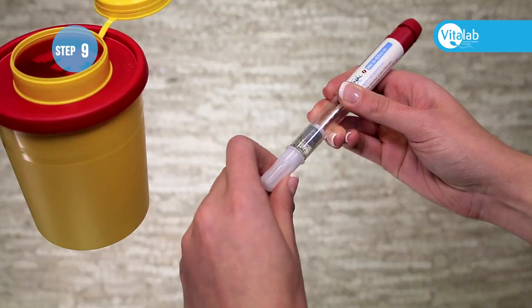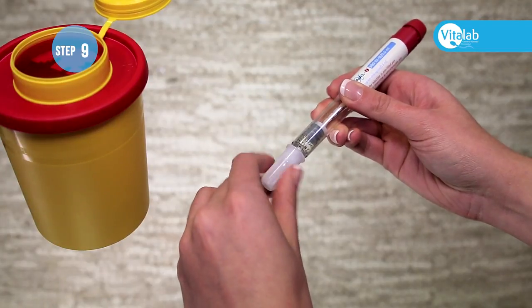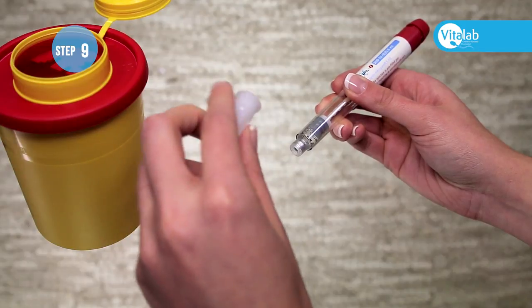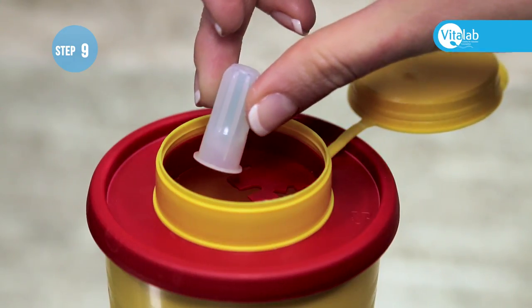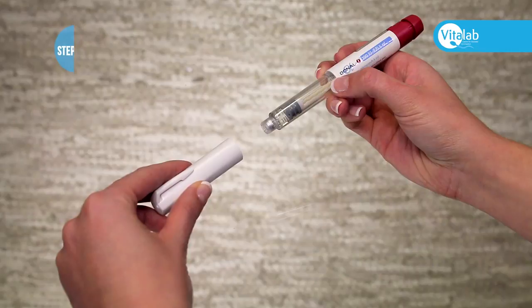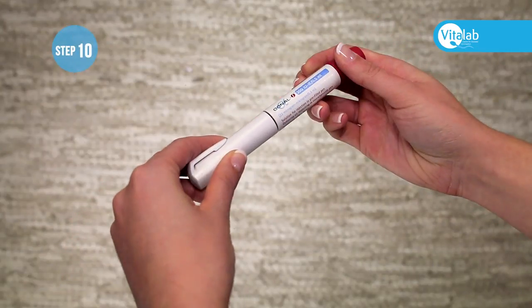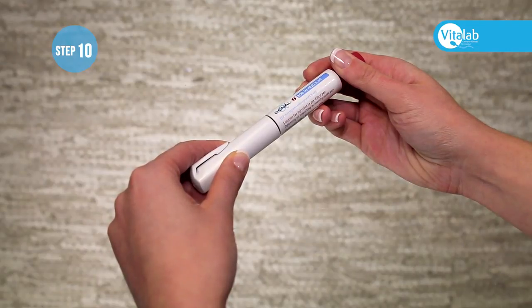Cover the needle with the white plastic cover. Unscrew the needle from the pen and discard. Put the cover back on the pen and place it in the refrigerator for use for your next injection.